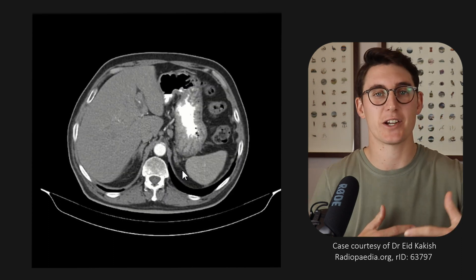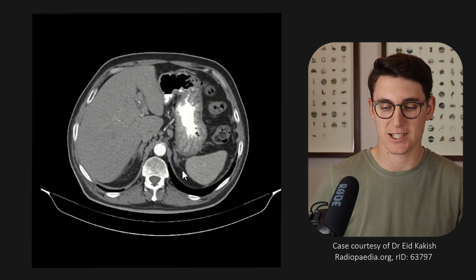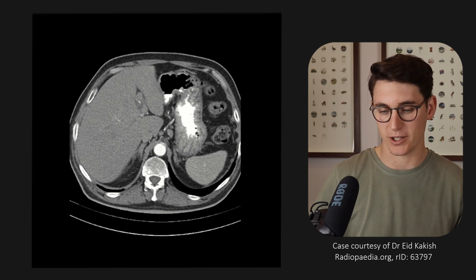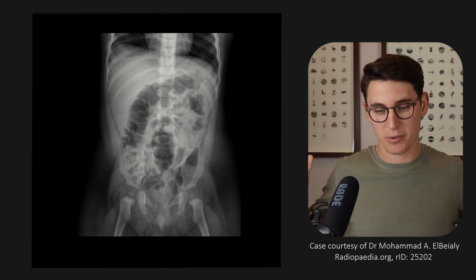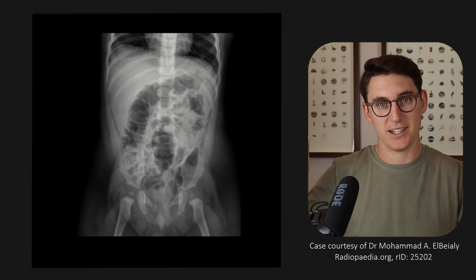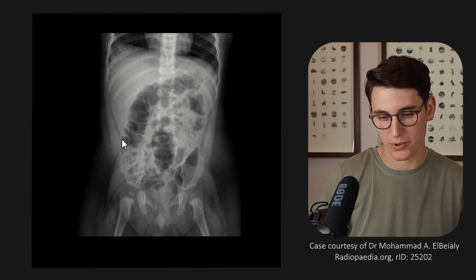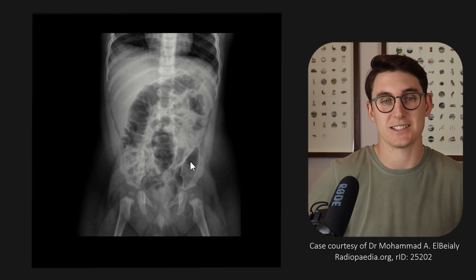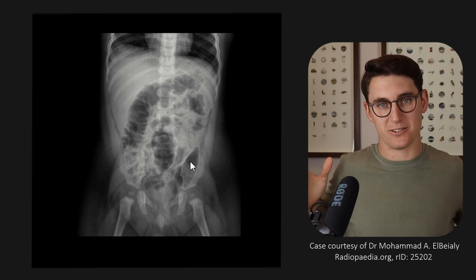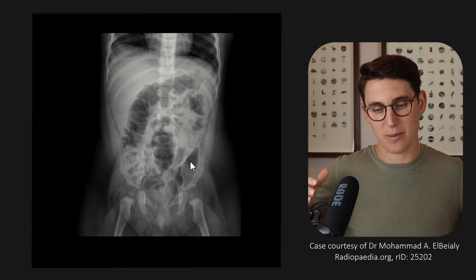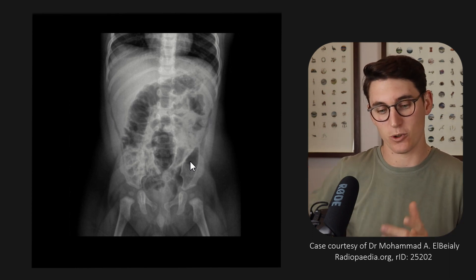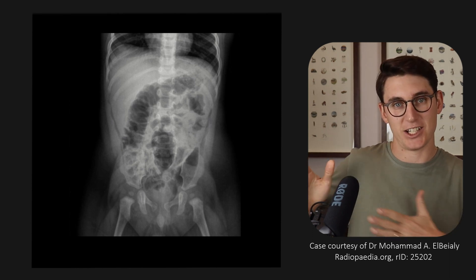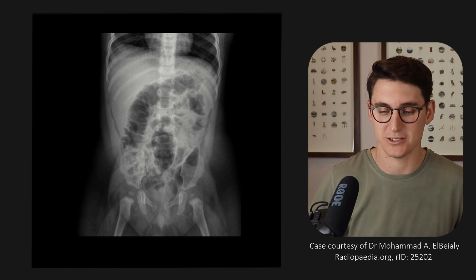So there we have it — we can split the retroperitoneum into three different segments. I also thought it would be interesting to show you an x-ray. As we see that posterior pararenal space coming round with fat in that space, we can see on an x-ray a preperitoneal fat stripe coming along here. We can sometimes think this is air within the abdomen, but that's just the retroperitoneal fat coming around the sides of the abdomen, with the posterior border being our transversalis fascia and the anterior border by this point being our peritoneum — so it's on the outside of our peritoneal cavity.